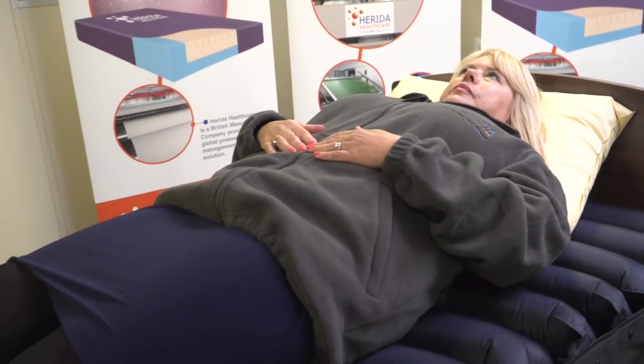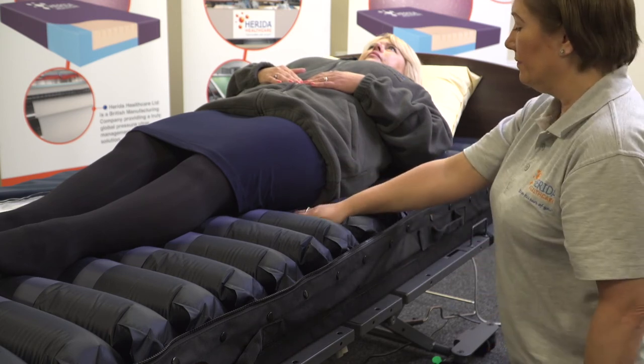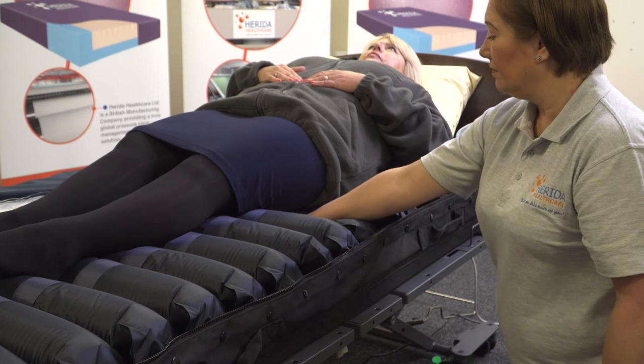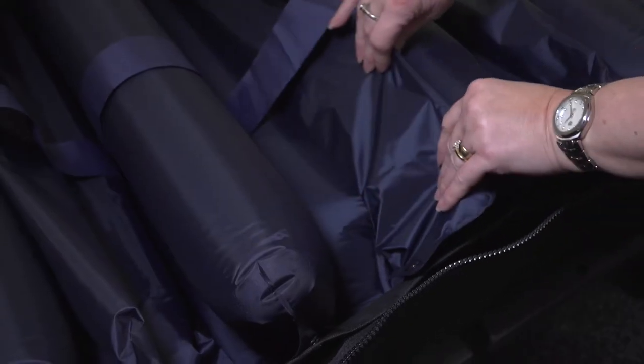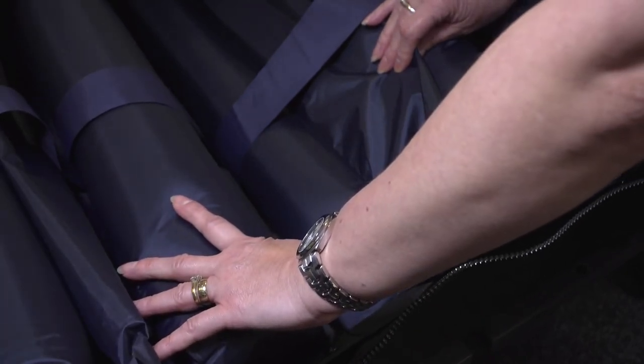The patient currently using the Argyle II is in the supine position. You can also see that every other cell is deflated. As I place my hand between the body and deflated cells, we can feel and see that there is sufficient clearance, providing the patient with relief. The rapid cell deflation system is unique, as pressure relief happens much quicker than on a standard dynamic system, offering immediate relief. The Herida Argyle II has a second layer of static cells underneath the alternating cells, which prevents any bottoming onto the bed frame.